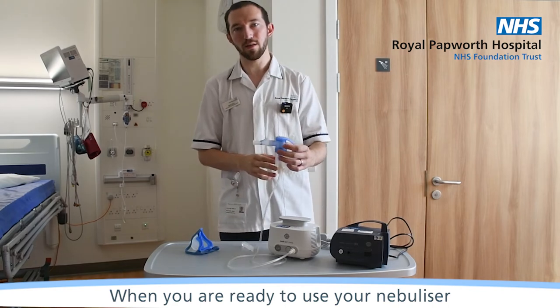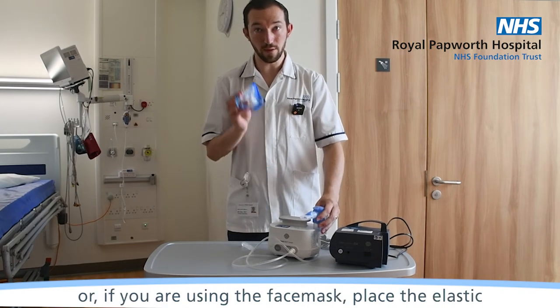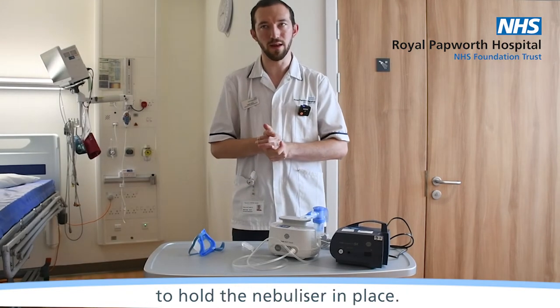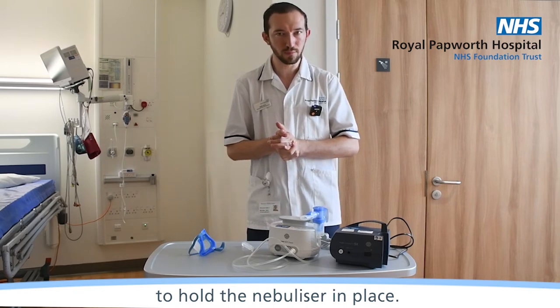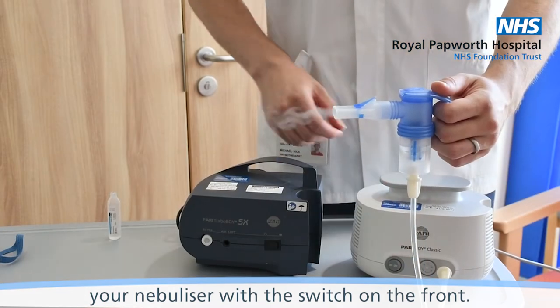When you're ready to use your nebuliser, either place the mouthpiece in your mouth, or if you're using the face mask, place the elastic around the back of your head and use that to hold the nebuliser in place. You are then ready to turn on your nebuliser with the switch on the front.